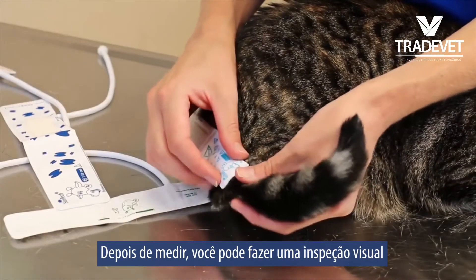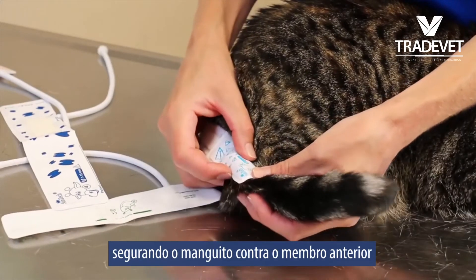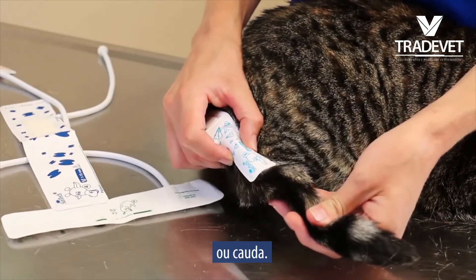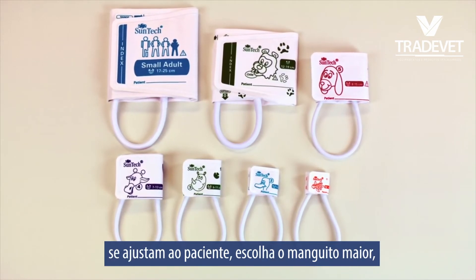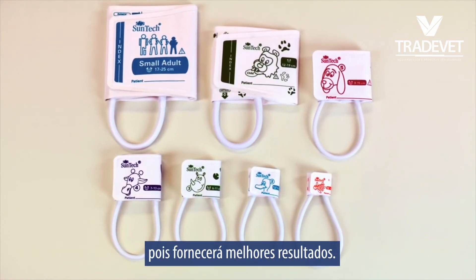After you have measured, you can do a visual inspection by holding the cuff against the forelimb or tail. For both methods, if two cuffs fit the patient, choose the larger cuff as this will provide better blood pressure results.